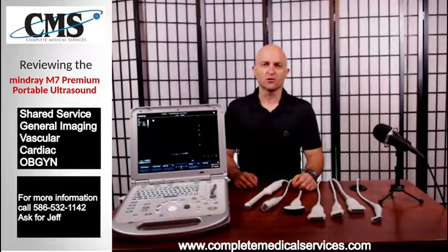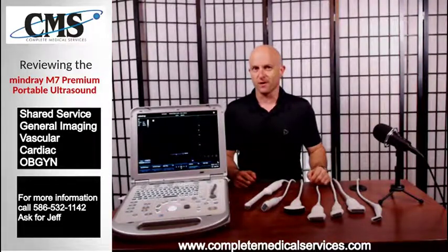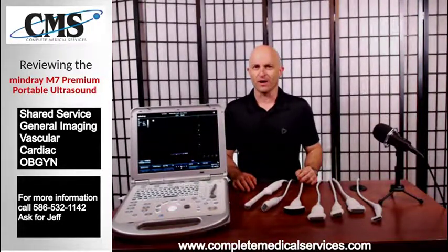The Minray M7 is a good quality, affordable, portable ultrasound with many ultrasound transducers to choose from. Hi and welcome to Ultrasound Review. My name is Jeff Rubinoff with Complete Medical Services.